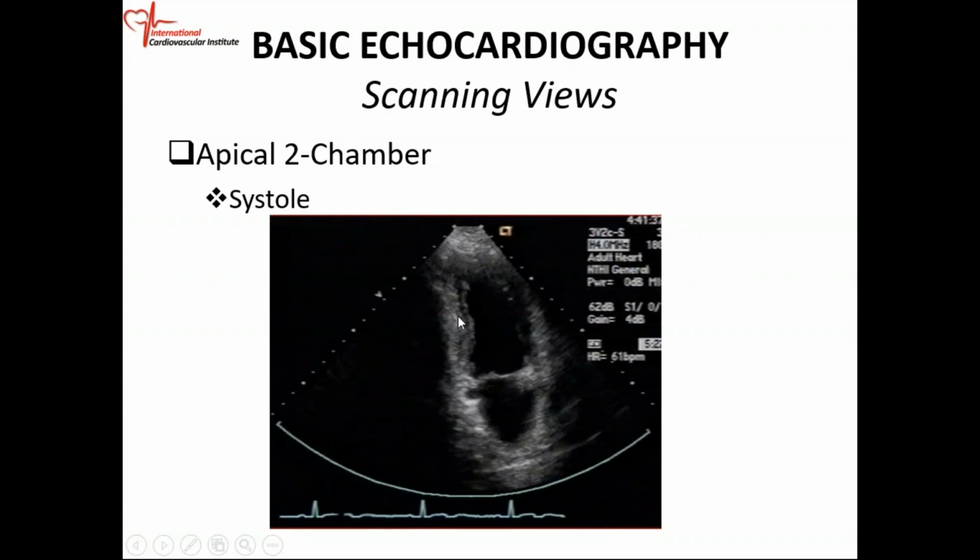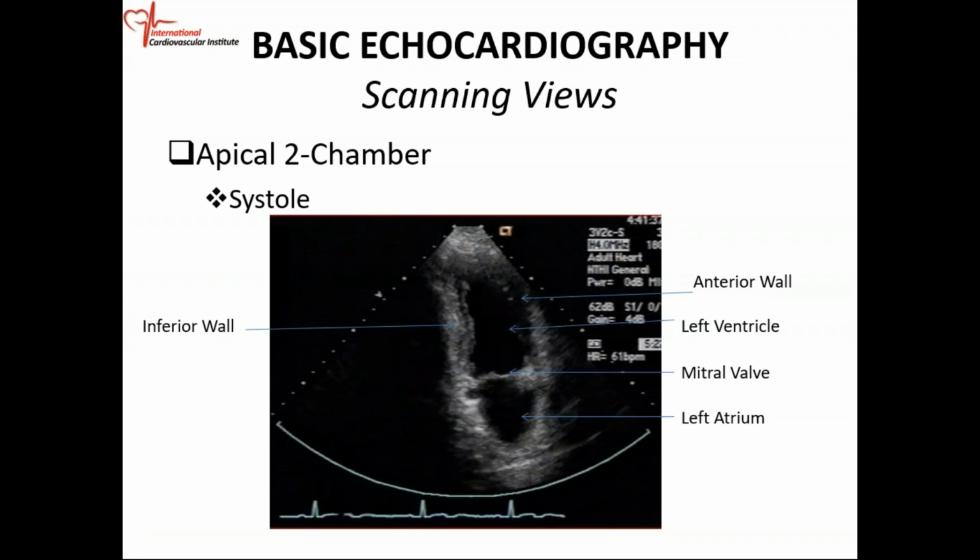This is the inferior wall. This is the anterior wall. Anterior wall, LV cavity, mitral valve, left atrium, inferior wall.